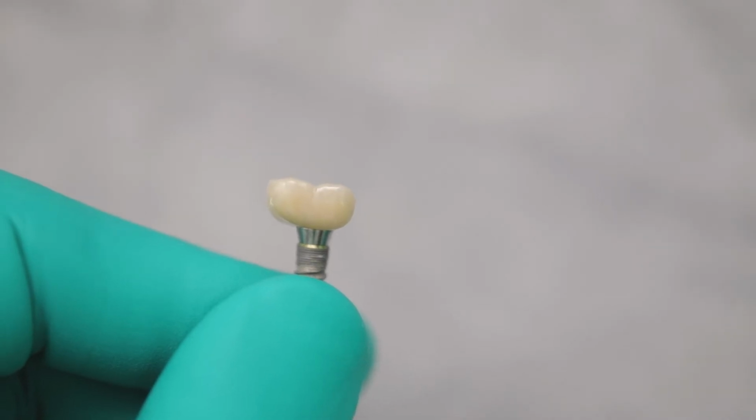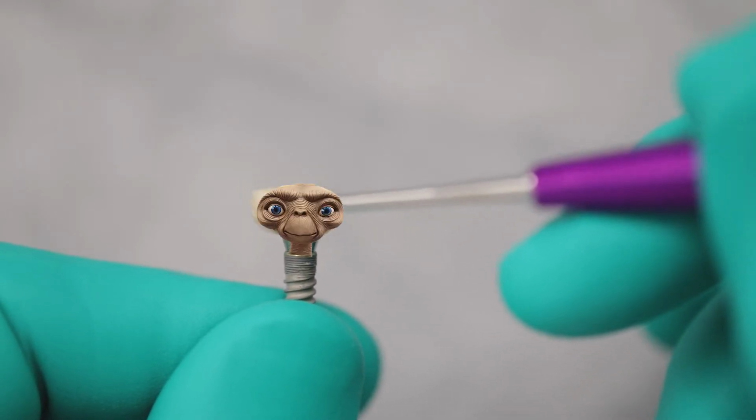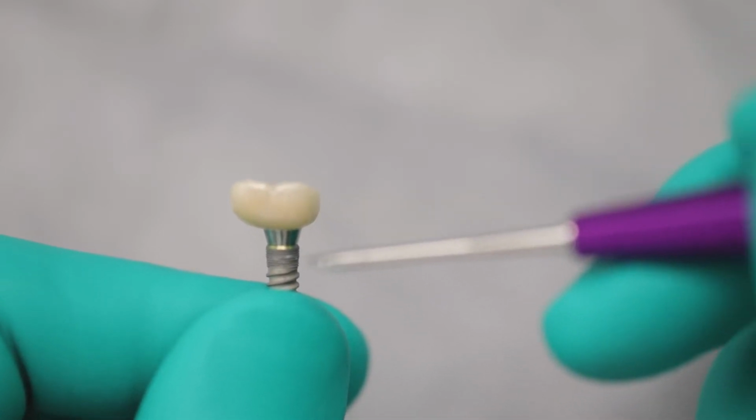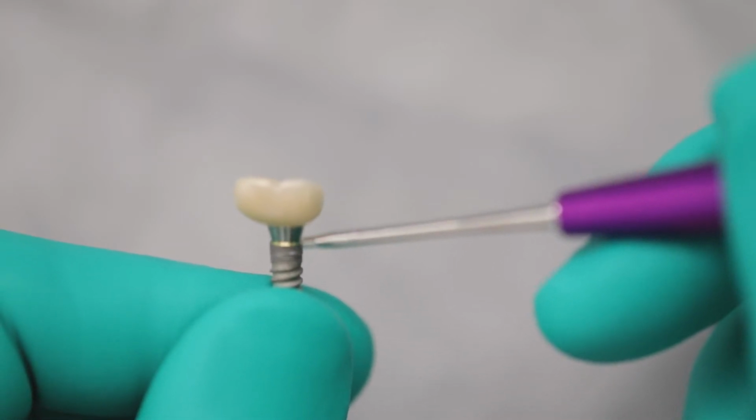The second shape that I'd like to discuss with you is our ET. This is a prime example of an ET case. So to me, it looks like ET. If you have a little eye here and an eye here and a little grin right here, this looks like an ET. And so what happens with these cases is, if the platform of the implant, let me get it in focus here for you.